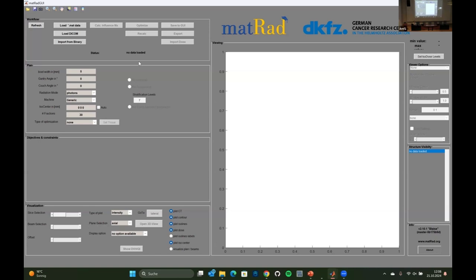So the data set was created by a few colleagues in the field to really have volunteers with segmentations, where at the time it was created, it was regulatorily very easy to distribute this. So that's the background of the data.